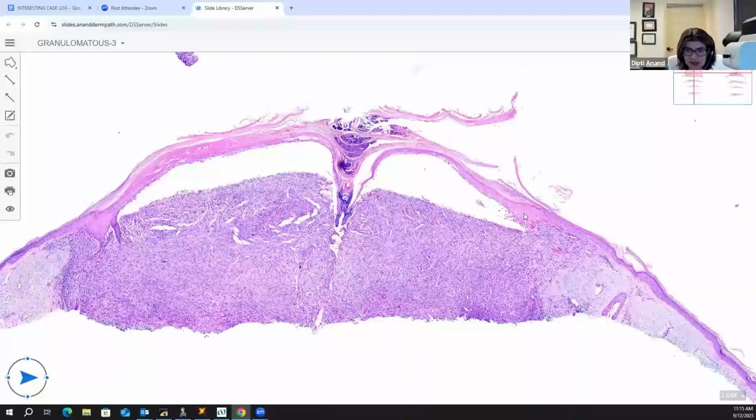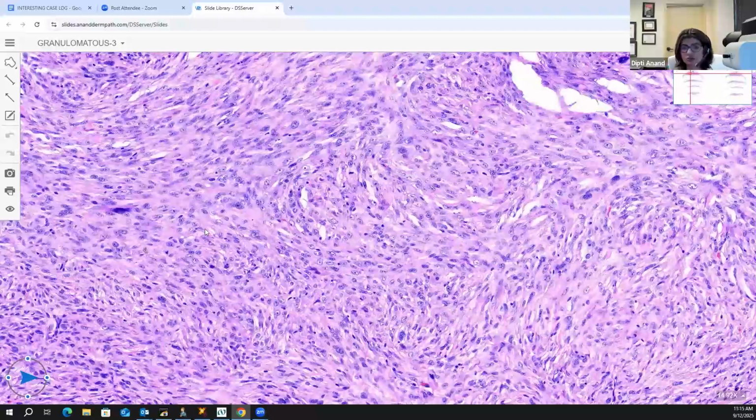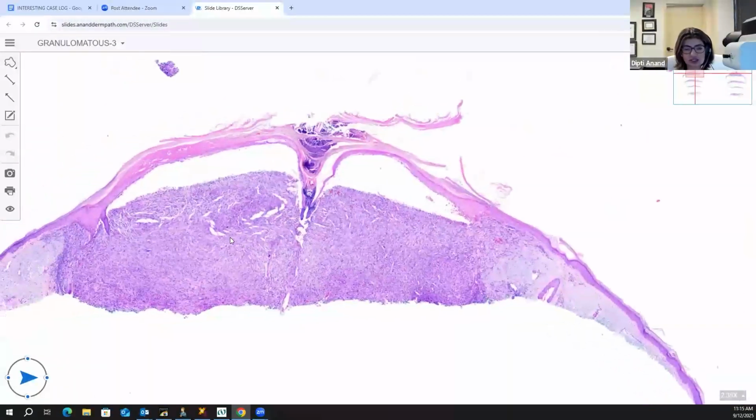It's a tumor that abuts the epidermis arising from it. There is an artifactual cleft beneath it, I don't know why that has happened. The tumor is just separated off. But you can see the location is classic. There is sun damage. And then when you go up on high power, there are haphazardly arranged fascicles of spindle cells, markedly pleomorphic, ugly, some multinucleated, but this is an AFX. Okay, so the second order questions that they will ask you.